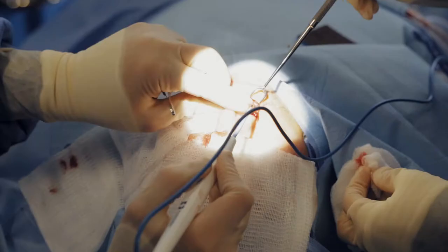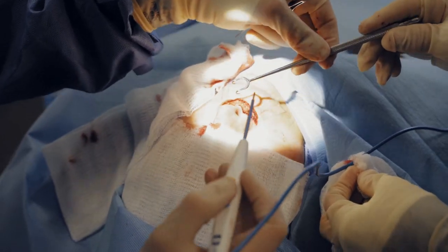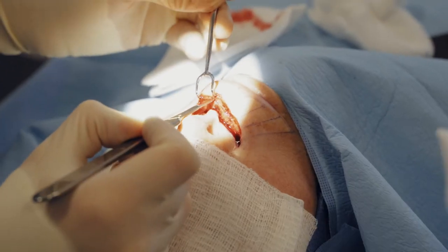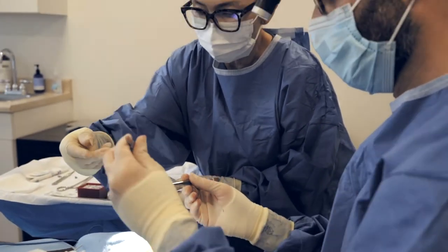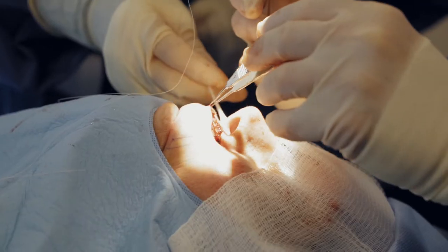What we're doing here is I've done the lip lift dissection, and I'm doing a deep plane dissection of the lip lift in order to allow that skin and tissue of the remaining upper lip to come up to give that nice roll to the lip. The goal is to anchor that tissue to this area of the nose in order to not allow the nostrils to change.